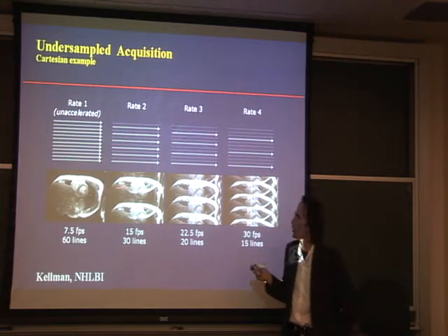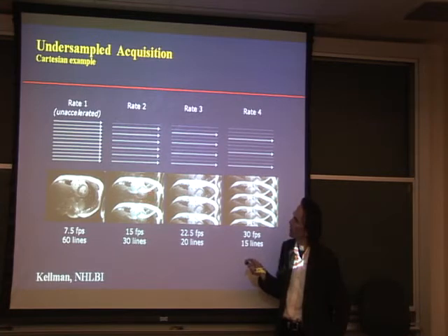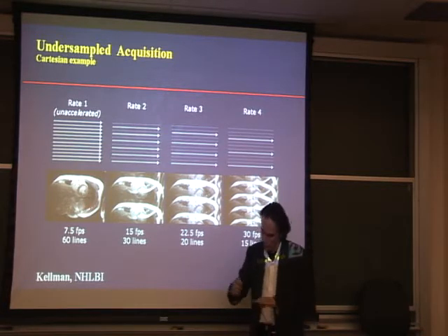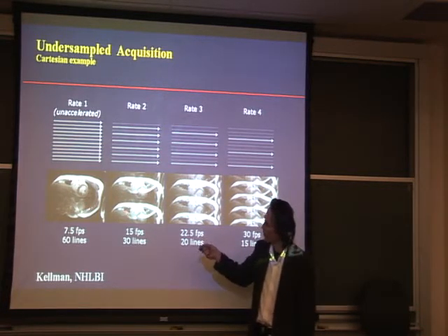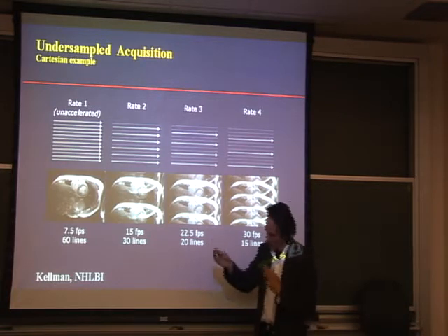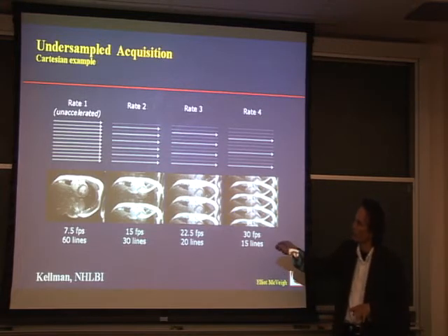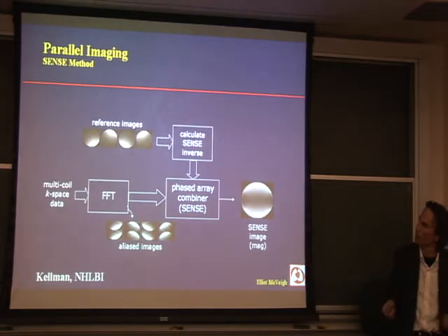The interesting thing is, here's the business end of this image. I'm interested in this part. This junk here is overlapping what we're trying to look at. But we know if there's a little coil here, and it only acquires data from here, it really doesn't contribute a heck of a lot from stuff up here. We know basically how to reposition this signal back down here. So it becomes basically a linear algebra problem, looking for the least squares solution for getting this image back from this, once we know where those coils are.